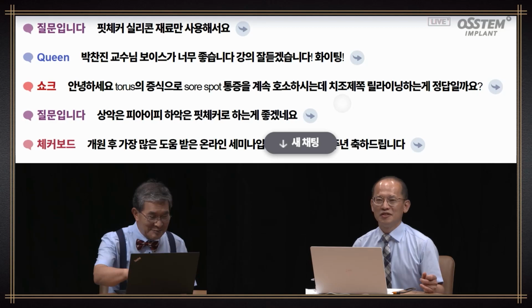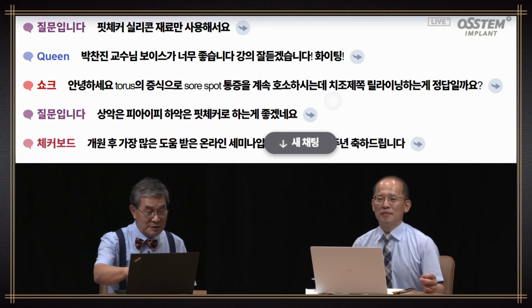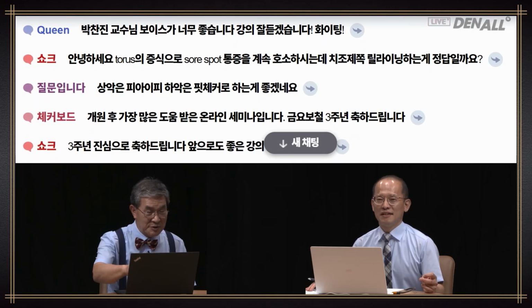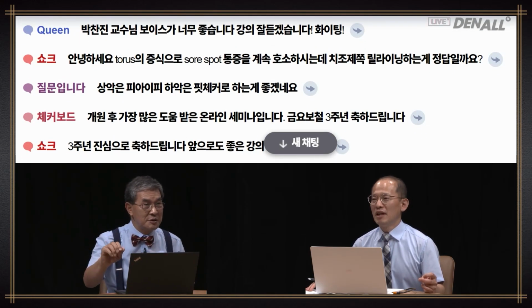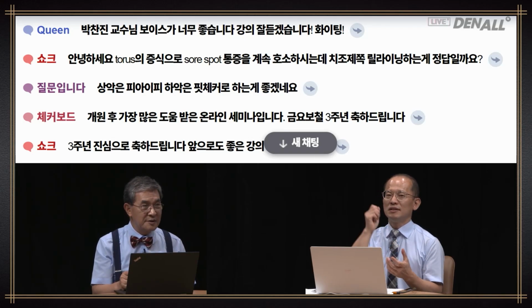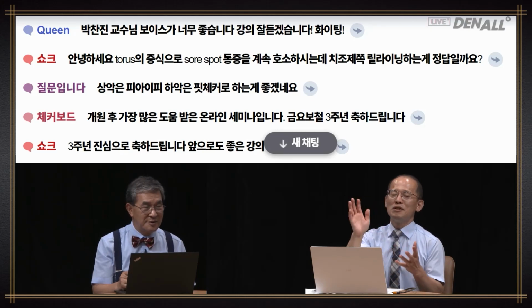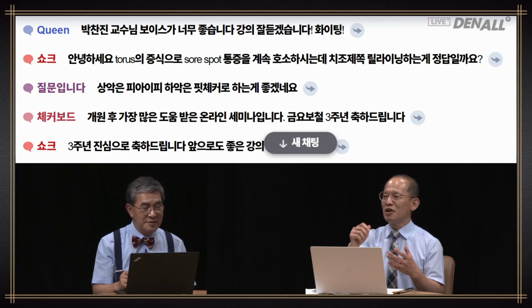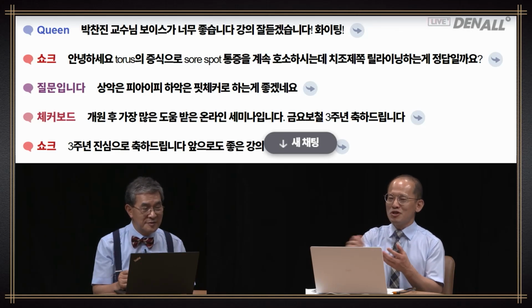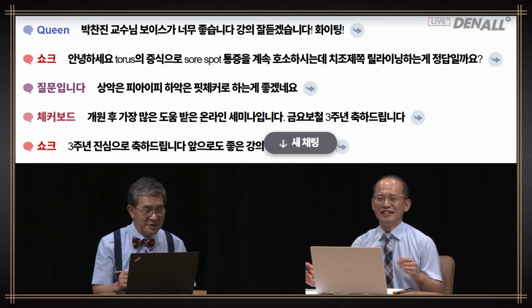Okay, another question: only use Fit Checker. That seems to be the answer. With Fit Checker, there's a lot of loss of volume. So PIP is better. Yes, PIP is more burdensome, but for the brush, you could use a toothbrush, and there's no know-how needed. You just brush it and then swipe it away with alcohol.